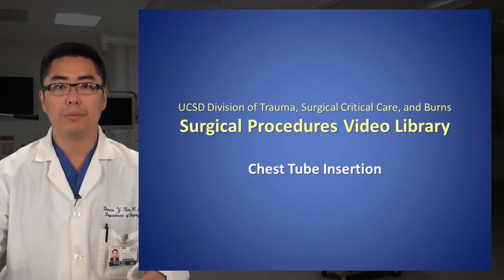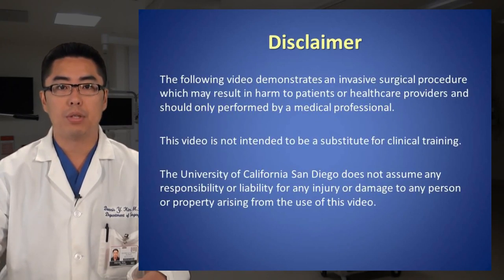Chest tube insertion. The following video demonstrates an invasive surgical procedure which may result in harm to patients or healthcare providers and should only be performed by a medical professional. This video is not intended to be a substitute for clinical training. The University of California, San Diego does not assume any responsibility or liability for any injury or damage to any person or property arising from the use of this video.